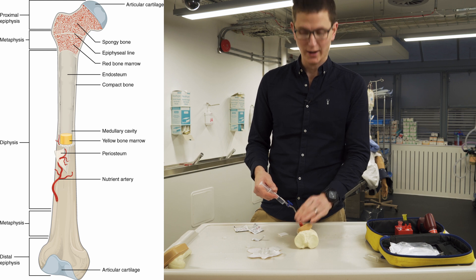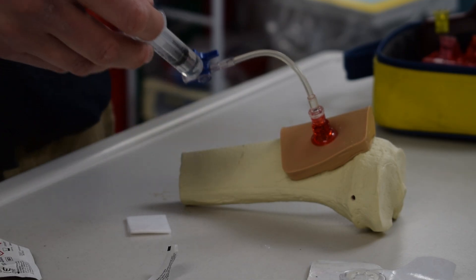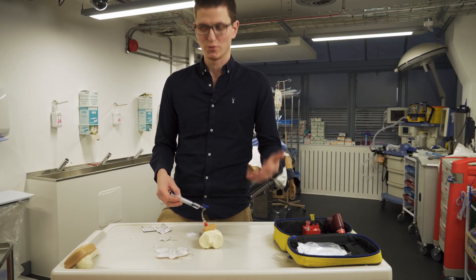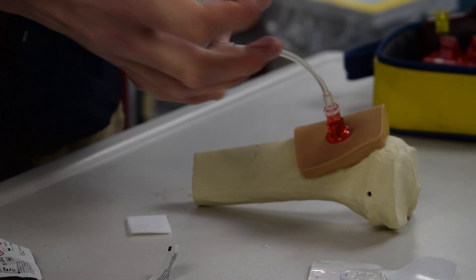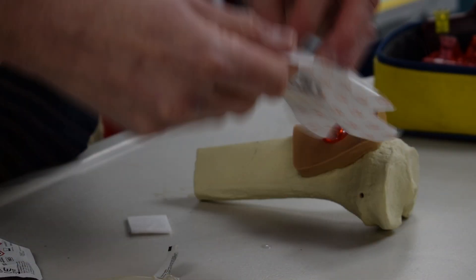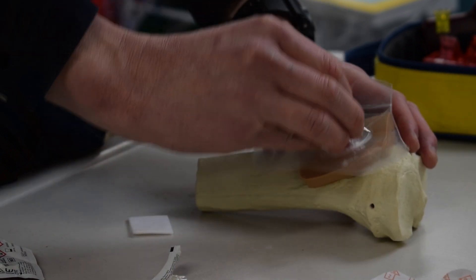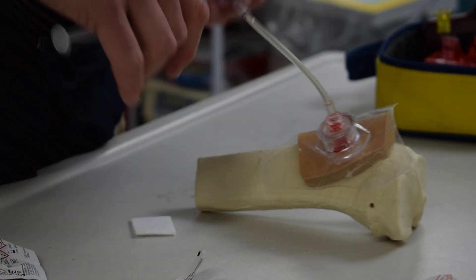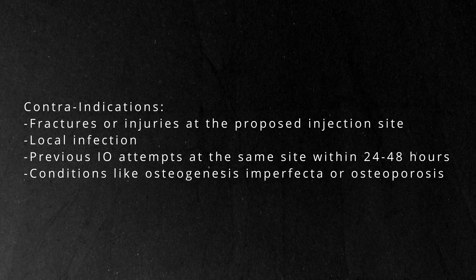At this point, we should be applying quite a bit of pressure to flush with some force. Some say you can flush with lignocaine, but typically the patient is in a really bad position and this is an emergency - we need to get this done quickly. Flush hard and you'll feel a give, then it will be flowing freely. Now that we know it's in, we can detach and tie down. I don't want to waste a tie down if I don't know it's in. We tie it down to the leg and attach to the top - now we have our IO. We want to make sure the same bone is not fractured, so if the tibia is fractured we can't put an IO into that bone.